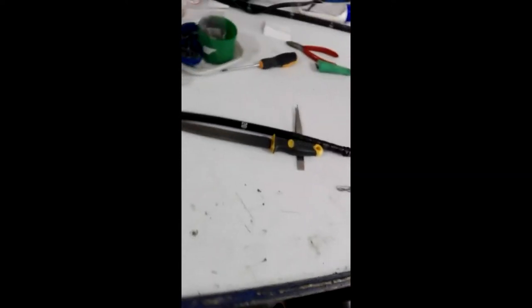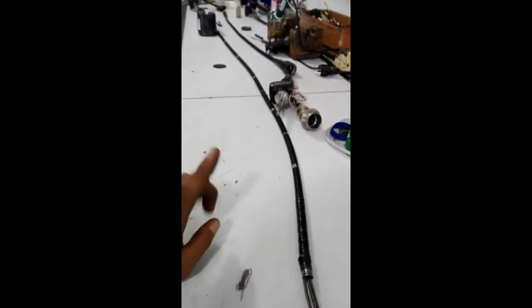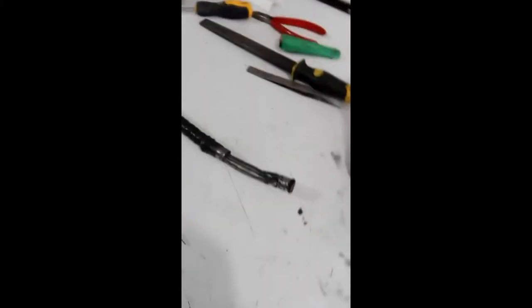Vamos ver agora as peças que compõem a parte interna de um endoscópio flexível. Sabemos que trata-se de um equipamento para visualizar as partes internas do sistema digestivo. Neste caso em particular, trata-se de um videoscópio 140L, fabricante Olympus.